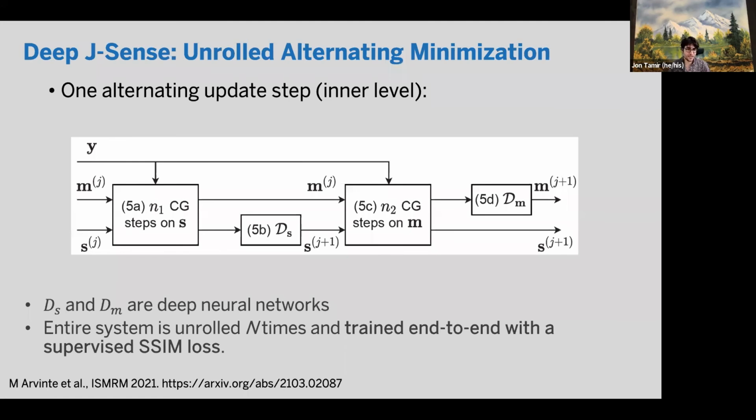If all of this data came from the same scanner with the same coil array, always scanning knees, it's true that the sensitivity maps will be different for each scan, but they will still be very similar to each other, because ultimately a coil placed in the top left of the knee is going to be sensitive to that region of the knee. So in order to handle that, we need to make this permutation invariant.